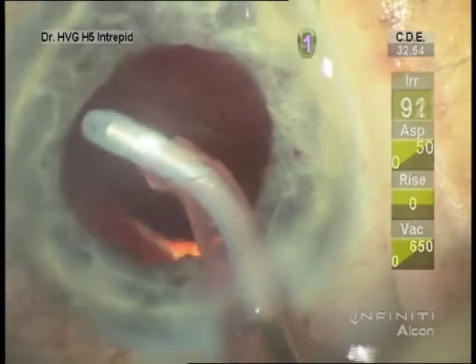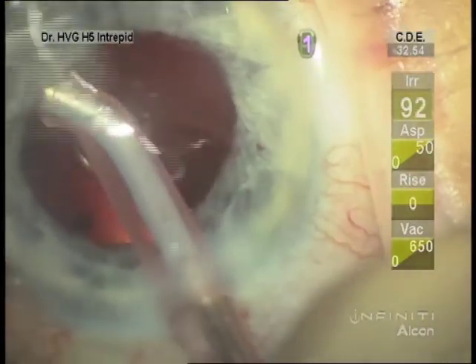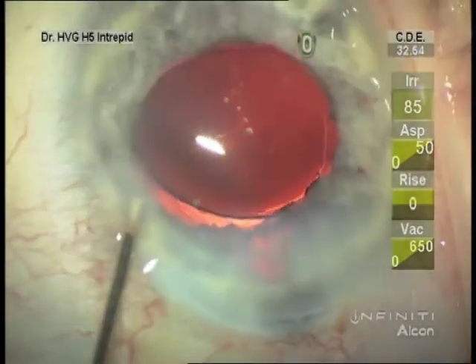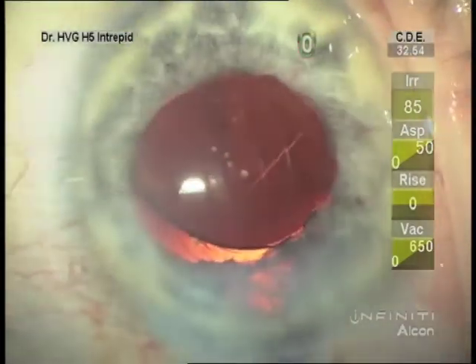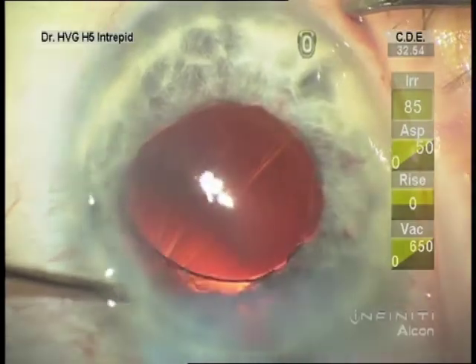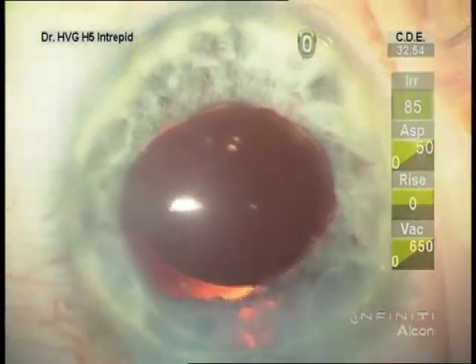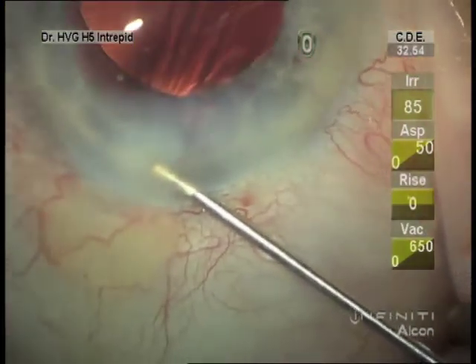Many times we do tear the sphincter a bit with the Malugan rings, and they don't constrict as they were before or even to normal. It's not unusual to lose a little pigment from the loops of the Malugan ring.